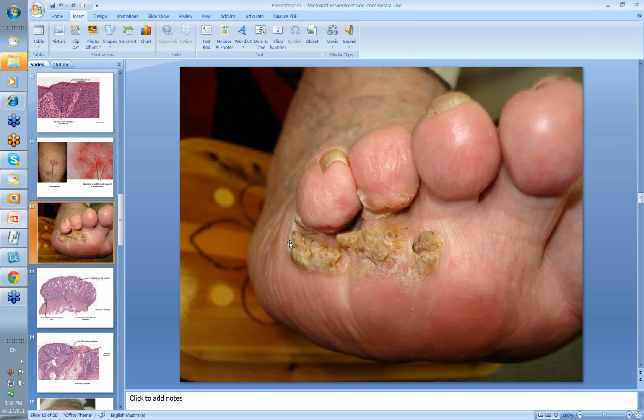Another type of SCC you can see is a Verrucous carcinoma. Now, as the name implies, this often looks like a large wart, and there's quite excessive keratinization, as is the case here. But this is really a well-differentiated SCC, but it's very slow-growing, and it pushes into the dermis, or at least it pushes from the epidermis inwards. Most of the time, this can still be confined to the epidermis, and only later on does it, in fact, break down into the dermis itself.